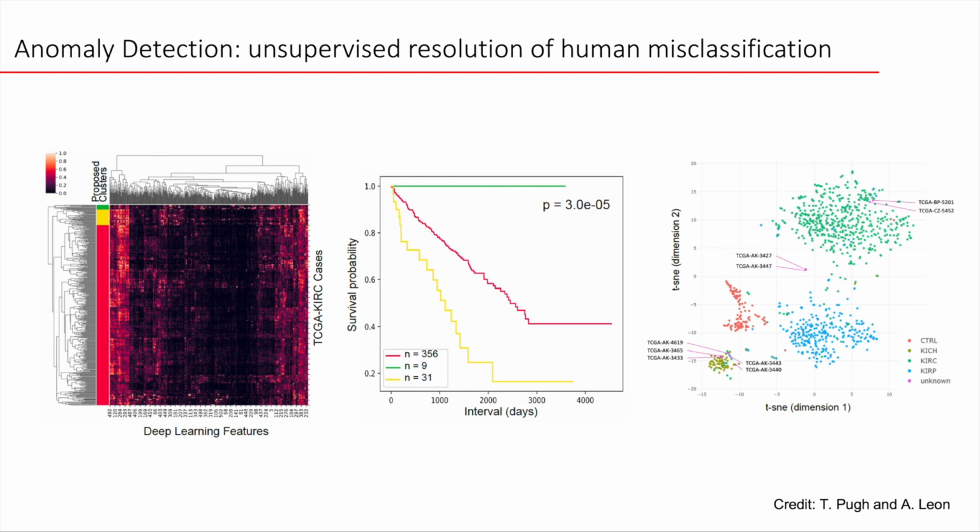And you can see that of these 9 tumors that had a superior prognosis, only 2 of them actually cluster with the clear cell data set. 2, as you can see here, are found very far away from any of these 3 sets. These are presumably oncocytomas. And then the remaining 5 cases actually correlated with the chromophobe transcriptional signature. So what we believe is that these are in fact misclassifications found in the TCGA cohort that account for the superior prognosis survival found in that green cluster.